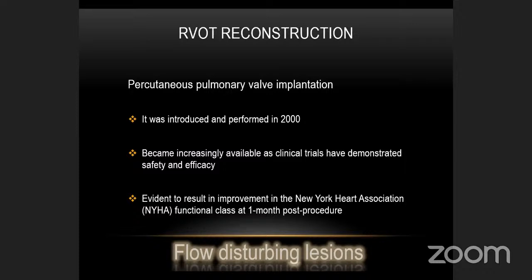Percutaneous pulmonary valve implantation was introduced and performed in 2000. It became increasingly available as clinical trials demonstrated safety and efficacy, with evidence of improvement in New York Heart Association functional class at 1 month post-procedure.